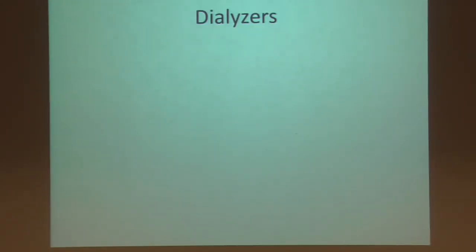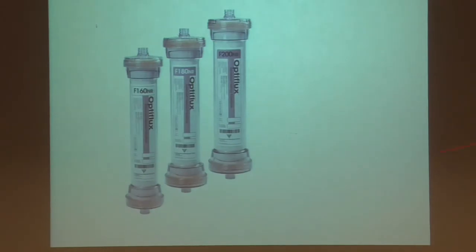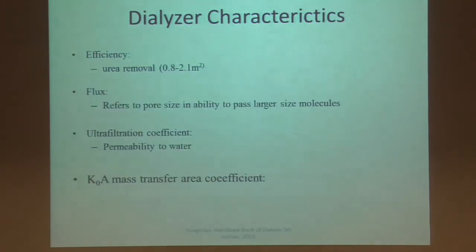This is the kidney, specifically. We'll see this filter sometimes. I just want to throw this slide in because in the chronic unit or in regular dialysis, we'll be messing with the filters for improved clearance. But when we're running SLED, we're running the smallest filter at a 160. So this is the next stage filter, but just characteristics of a filter.